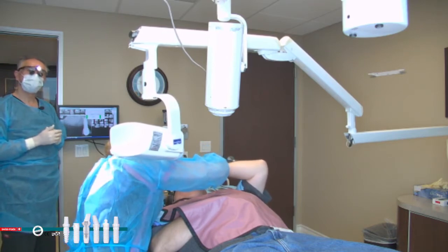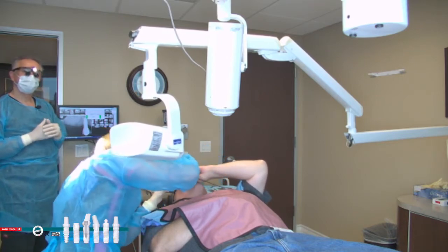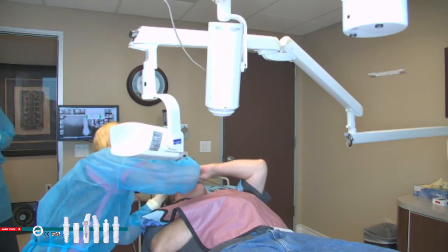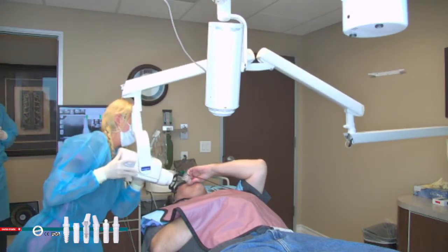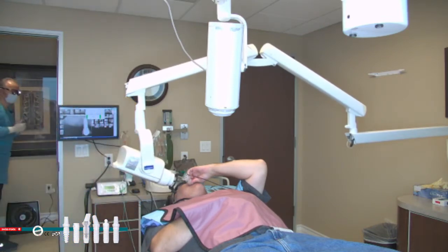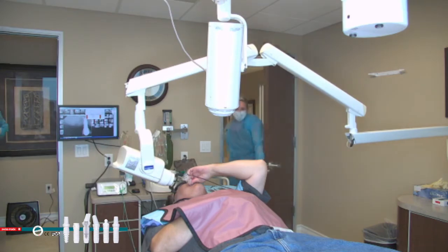Maybe you could talk about the radiograph and what it's like with a ceramic implant compared to a titanium, radiographically? Yes, great. Let's take this x-ray and then we'll talk about it. Open, you can take it out.